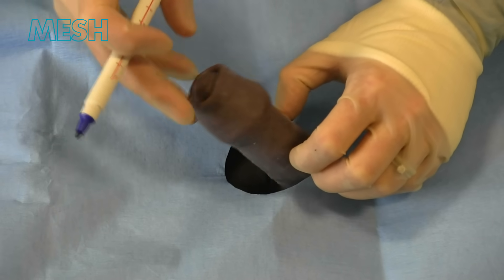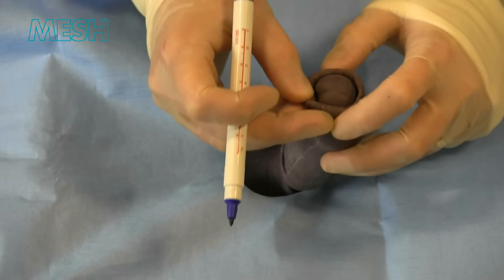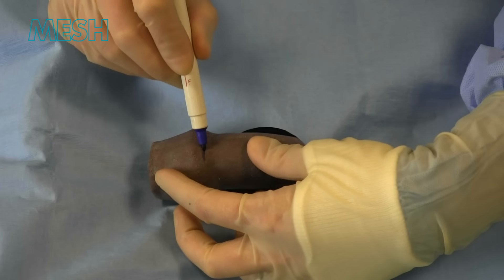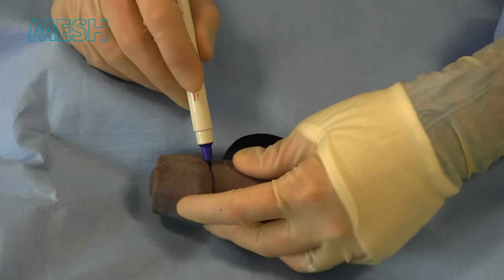We start with routine prep and drape and in this instance use a skin marker. We're checking that we can see the meatus and that there's no other issues, for example masses or abnormalities on the glans or foreskin.